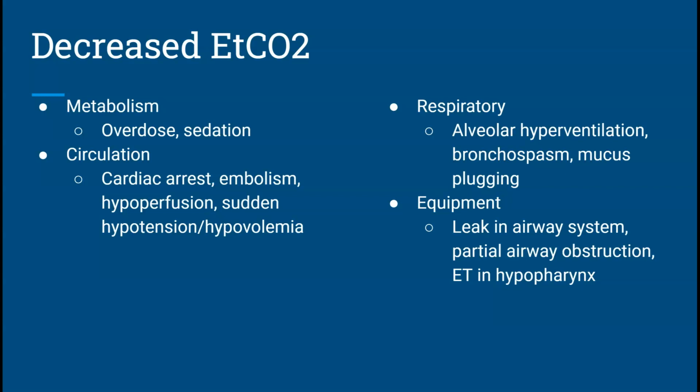Does that make sense? Okay. Also, when you're evaluating, if your tube is dislodged, or there's a hole in the pilot balloon, or you have a vent patient and there's a leak in that circuit somewhere, you'll end up with low end tidal as well.